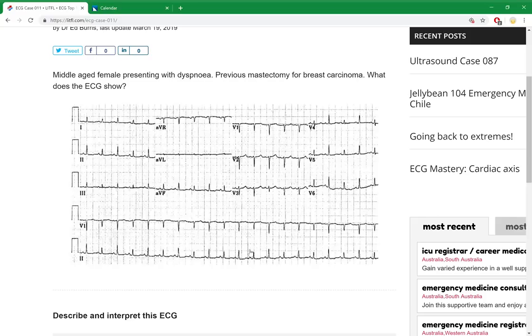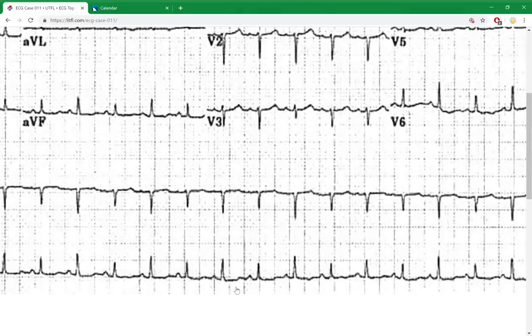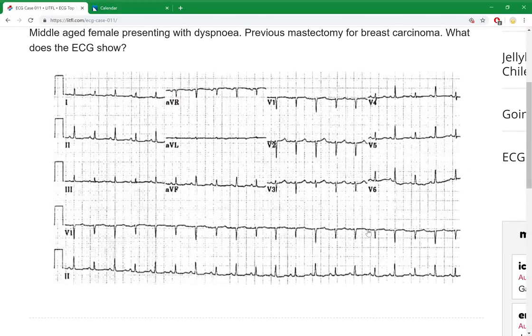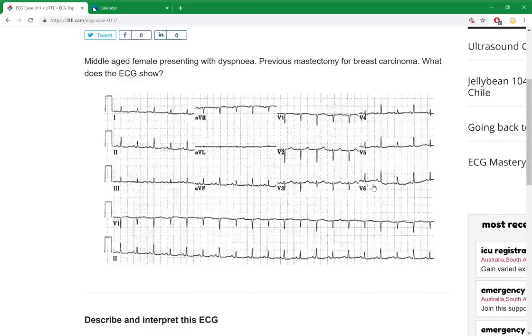And then if we look at the QRS heights, there's something interesting about them. So just take a second and look at them. Right, so it goes up, T wave, P wave, Q wave. So what's different about this and this and this and this and this? They're alternating, right? What do we call this in class? Electrical alternans. So something is causing the amplitude of each of these QRSs to sway, to shift.